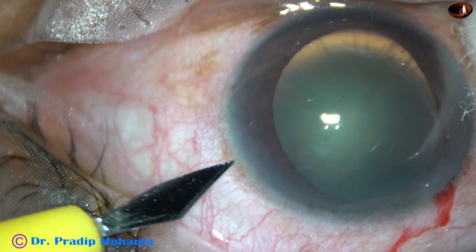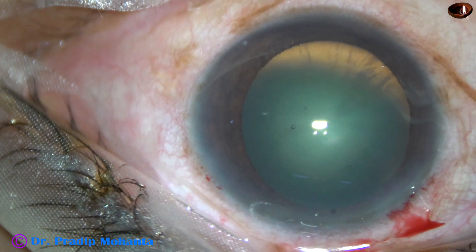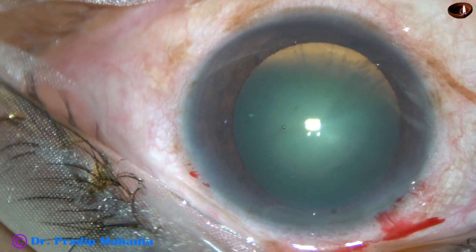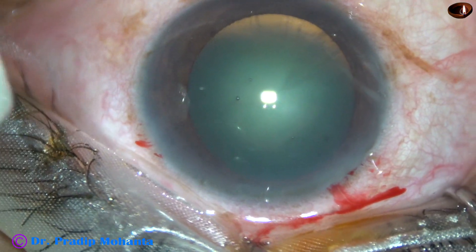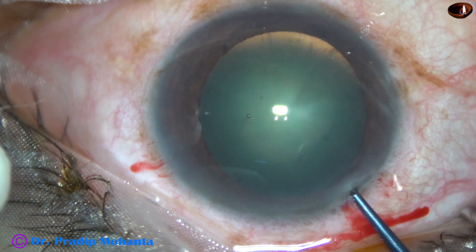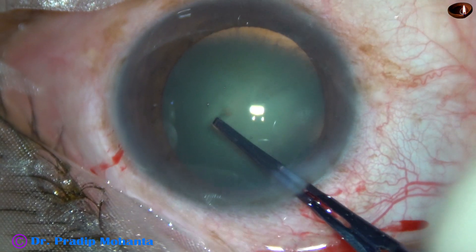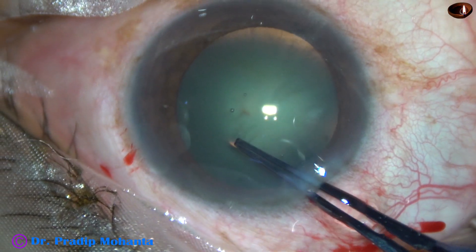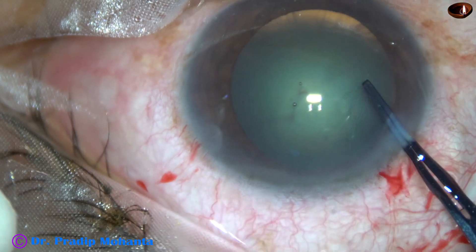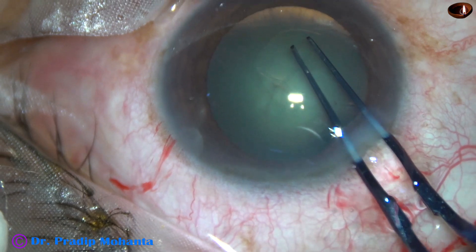This is a side port about 3 o'clock hours away from the main incision. When the side port is 3 o'clock hours away from the main wound, astigmatism induced by the main wound is neutralized to some extent by the side port. And if the width of the side port is a little more, neutralization is also a little more.